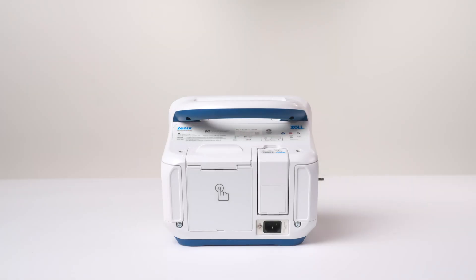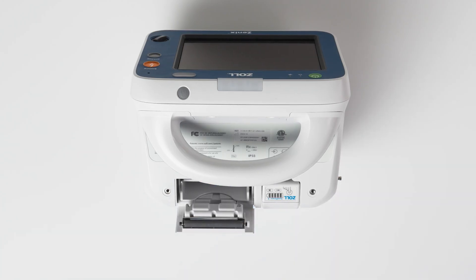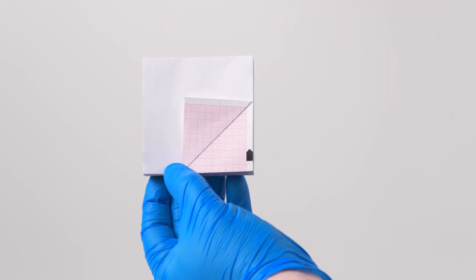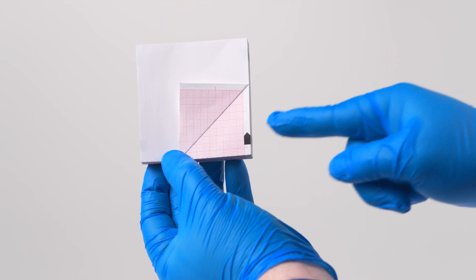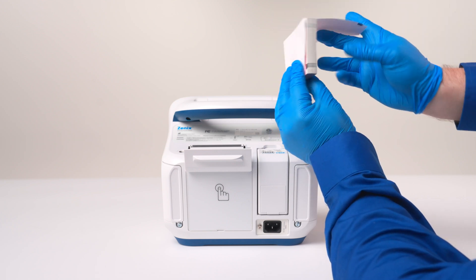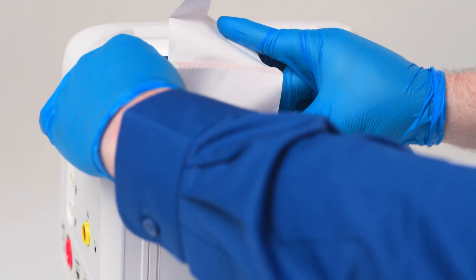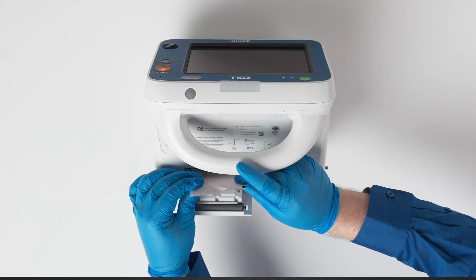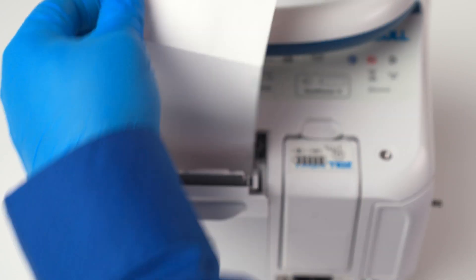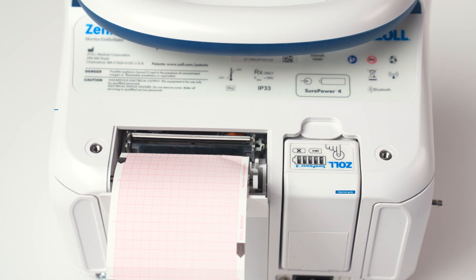Close the printer door. To change the paper while standing behind the device, open the printer door by pulling the door latch toward the back of the device. Open a new pack of paper and discard the cardboard. Hold the pack of paper with the corner fold facing you and the black arrow pointing up. Lift the corner fold to expose the pink grid. Turn the paper so that the pink grid faces away from you. Slide the pack of paper into the tray with the black arrow pointing up and the pink grid facing away from you. Pull one or two squares of paper out of the top of the printer. Ensure that the paper is aligned between two silver teeth on either side of the paper tray. Close the printer door.